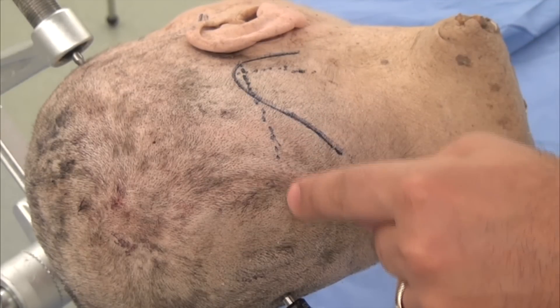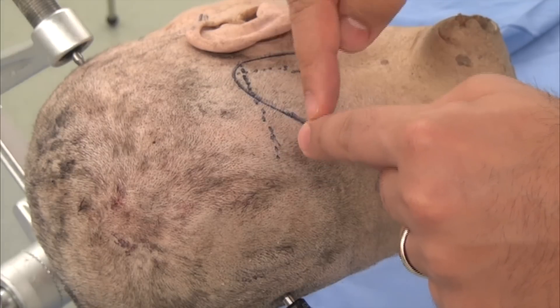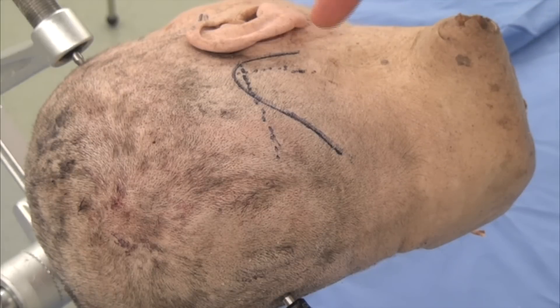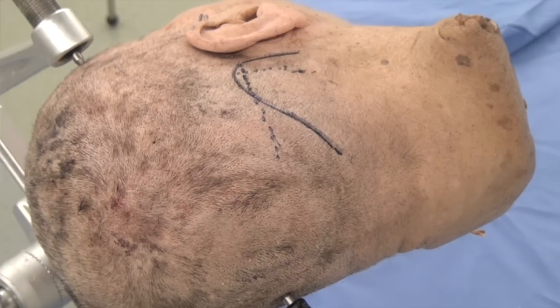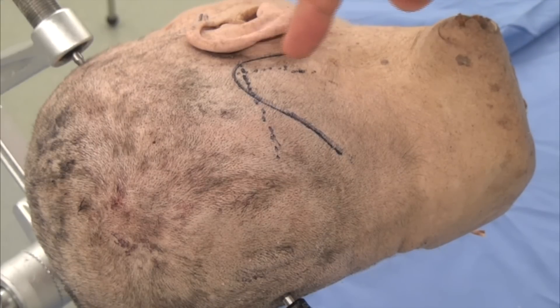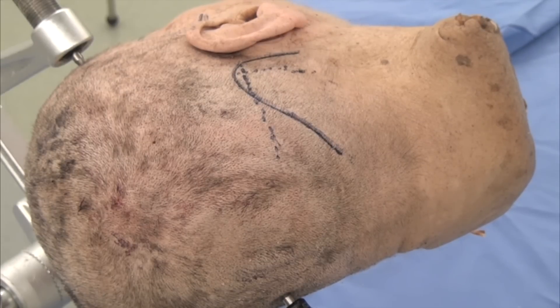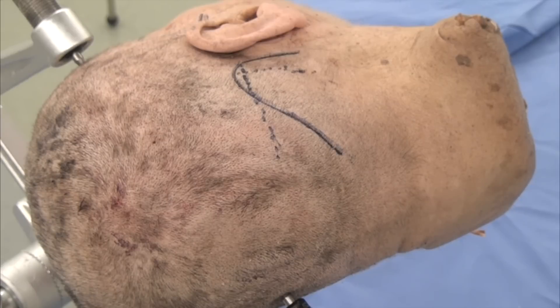We identify the inion and the root of the zygoma and we draw a hypothetical line. We then find the groove of the mastoid bone and extend the line straight vertical. Where they join is most likely where the transverse-sigmoid junction would be.